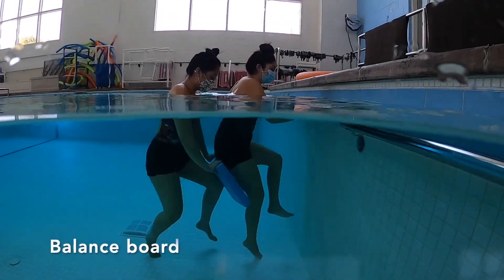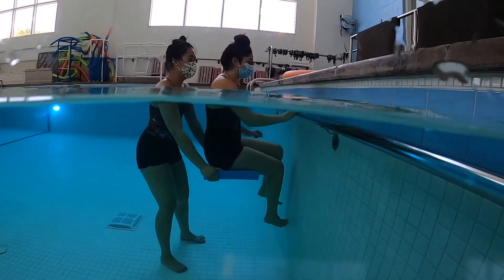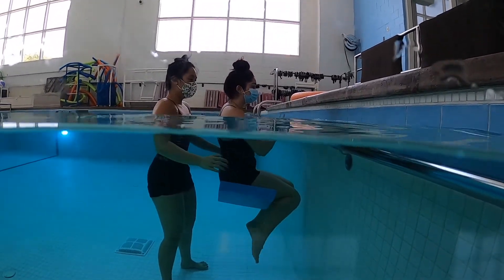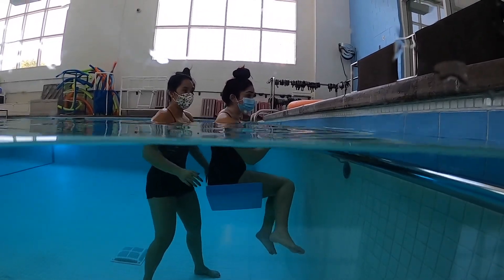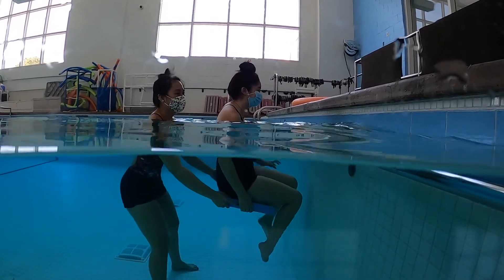When training balance and proprioception, it is ideal to set up in front of any railing for client safety. To set up the balance board, make sure the client is in front of the railing for support. Push the board underwater underneath the client and make sure they are safe and comfortable before proceeding.